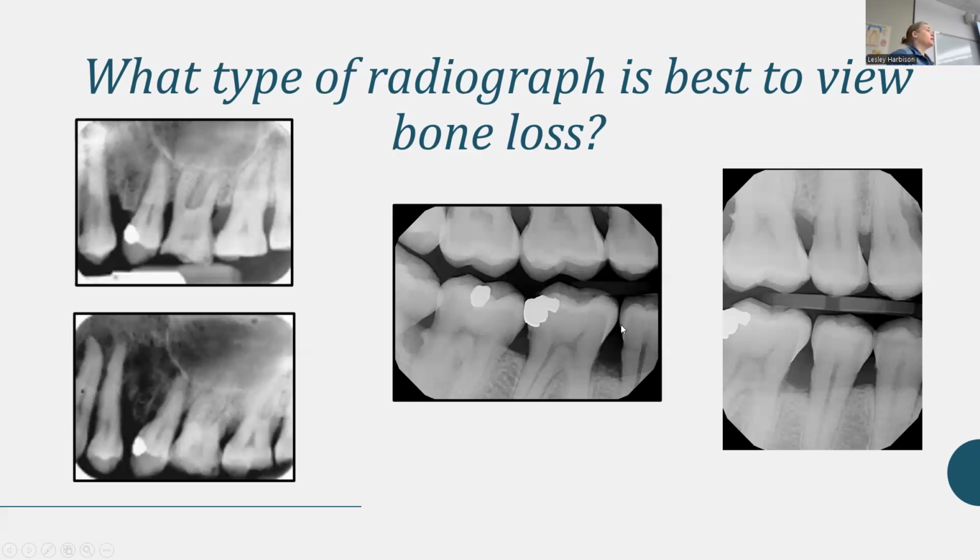And then bite wings are a really, really good x-ray, and we've talked about this already, for finding bone level. That's why I harp so much on it, and in your class I've certainly harped on it more. You've practiced it more because every year I'm like, okay, I know that by the time you take vertical x-rays, it could be your senior year.